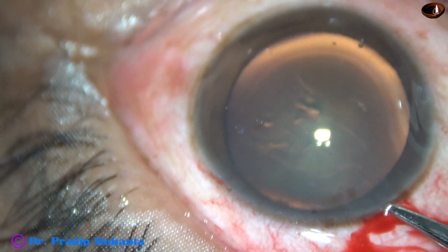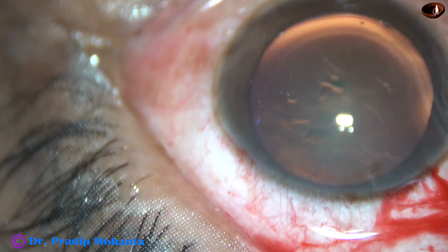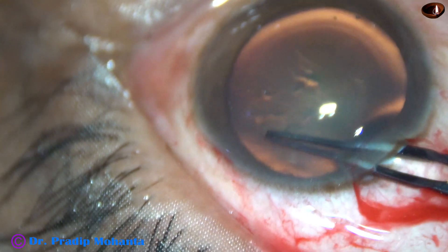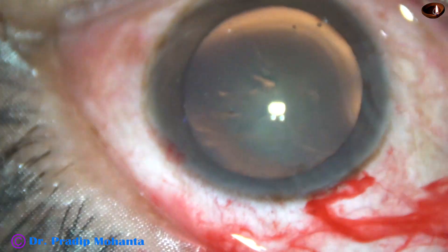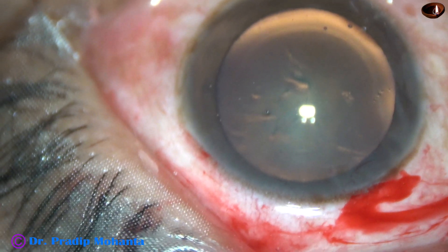Just cut the capsule here, hold this tag, go clockwise, and complete the rhexis. So there is a weak point at 2 o'clock, and there is extension up to the equator.